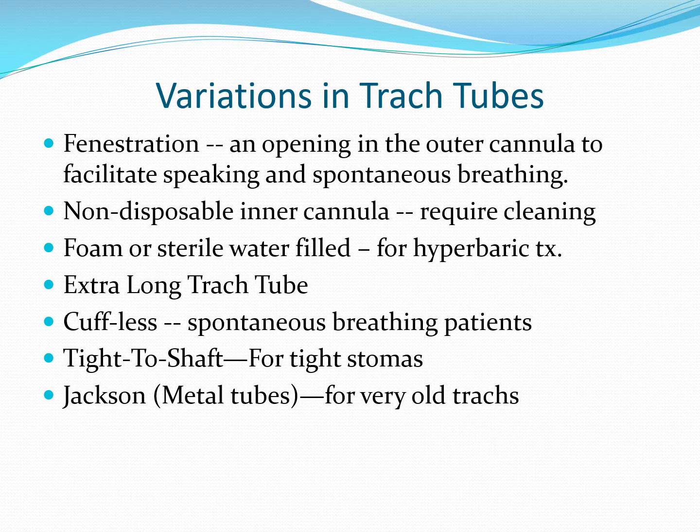Tight to shaft. I will show you an image later in this presentation on tight to shaft. So basically a tight to shaft cuff tube looks almost like an uncuffed tube. That cuff is made out of a silicone material that, when it's deflated, just adheres. There's no wrinkles in the cuff. It adheres to the outside of that trach, and it looks almost like it doesn't even have a cuff.